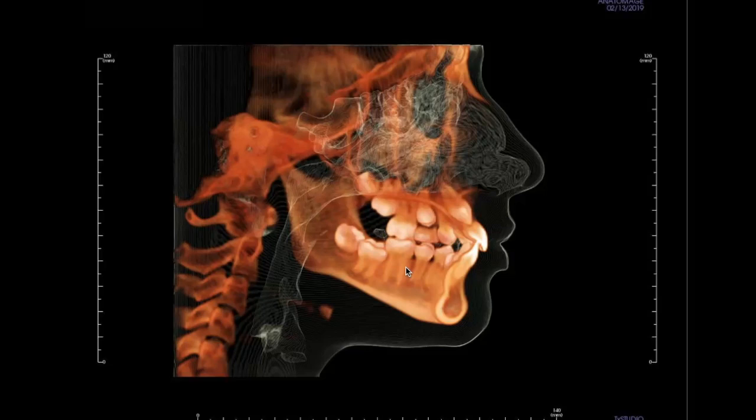Okay, they're unerupted, right? And they're really probably not supposed to be erupted yet, because the upper second molars are still not in as well, and they have plenty of space. So we have eruption in our favor. We have active roots, so hopefully those would come in.